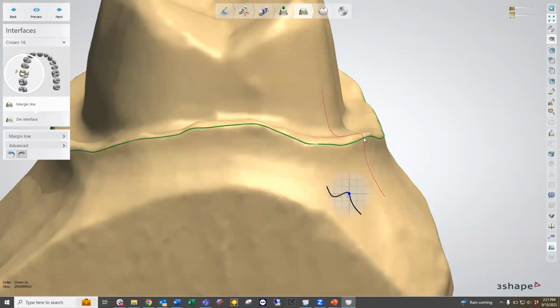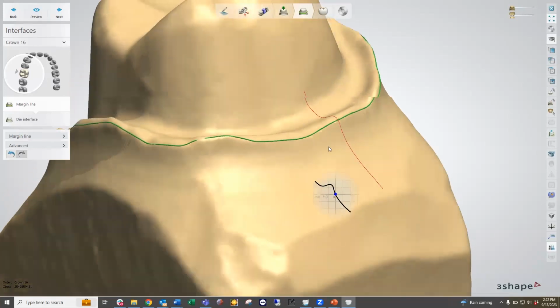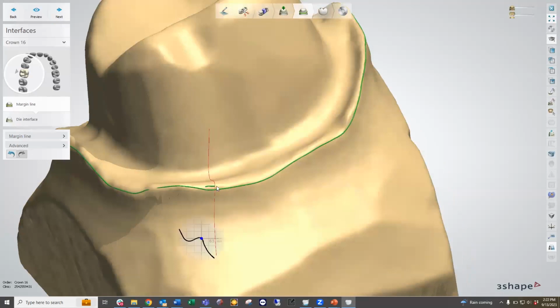So here I can see that my little blue dot down here is actually below the height of contour relative to that edge. So I'm going to drag this up to be located on that height of contour. All right, and I can follow the green line to ensure that my blue dot stays along that height of contour during this process. Okay, so I'm going to highlight this area a little bit further.